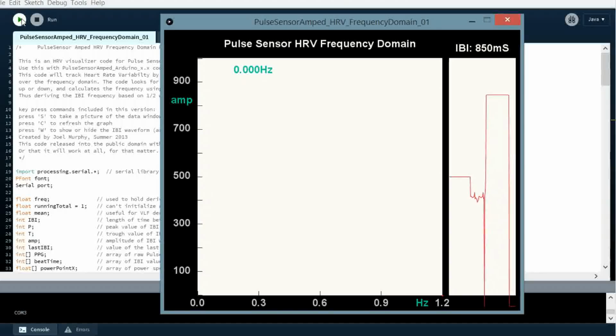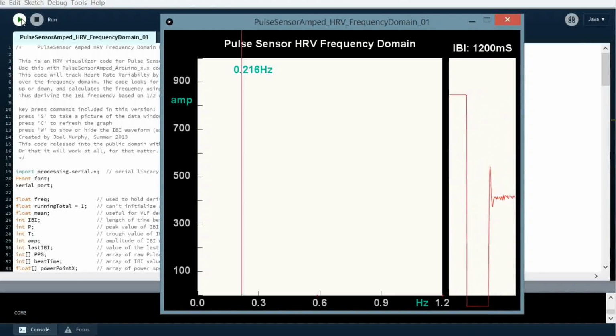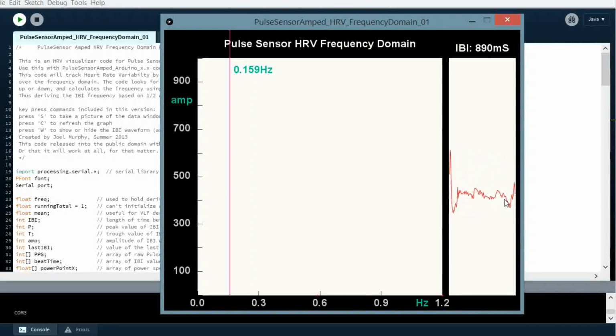So I put my finger on the sensor here, and as you can see, it is trying to print out my pulse data here. Give it a second to get my finger positioned properly. And see what we get. Alright, so I guess it's doing its thing, and 1200, that seems more realistic. But I don't know if you can see this thing printing out the dots. It will do it in all sorts of different spots.